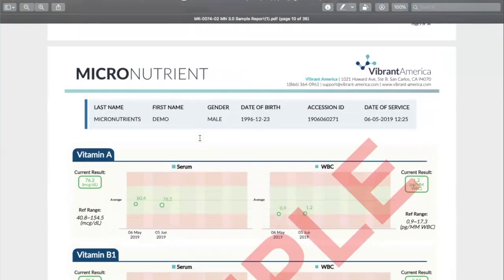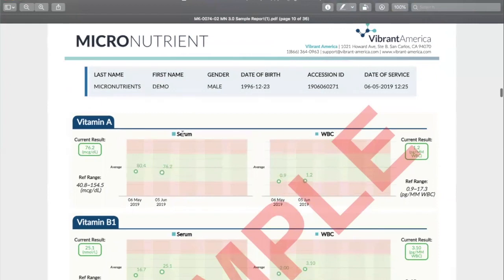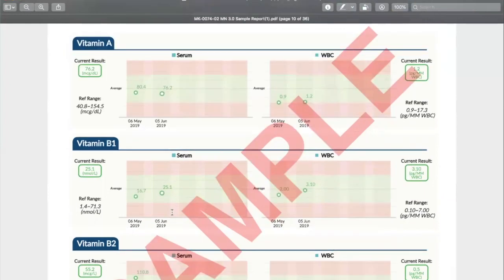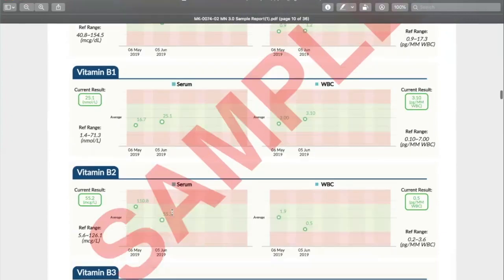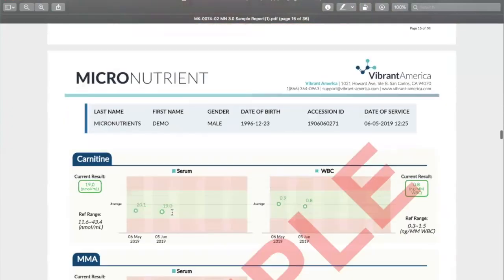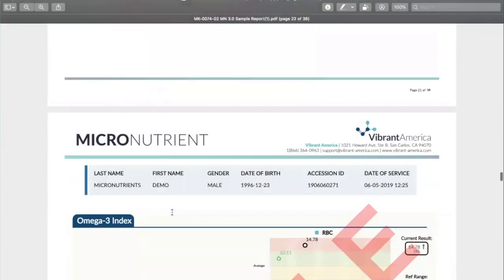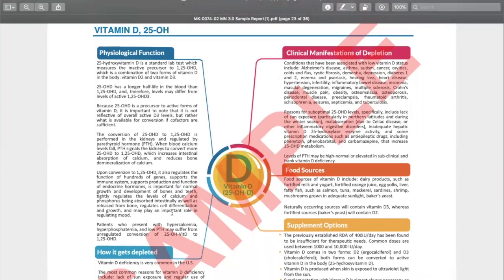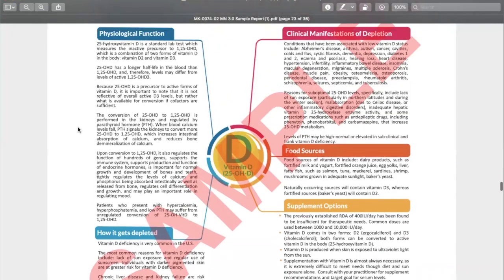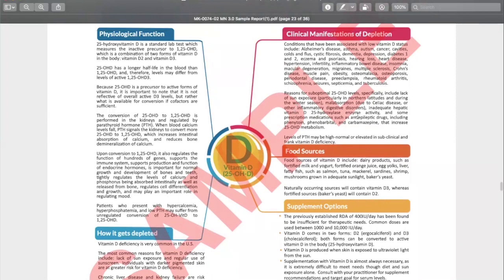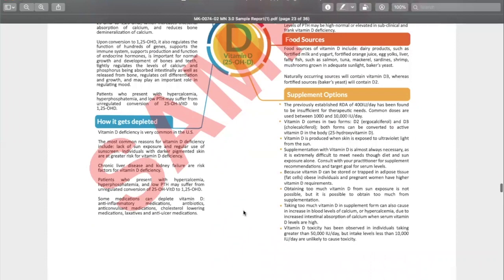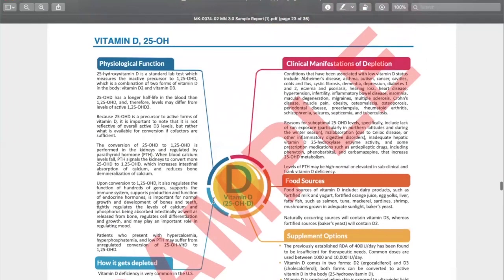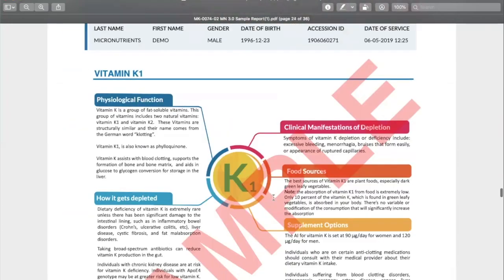If you want to dive even deeper and look at values in relation to the reference ranges, that's the next section — it's the same information presented in a slightly different format. Scrolling past all of these, the last feature of the report — which many people miss — is that for all nutrients with abnormal values, we give you a detailed breakdown of the nutrient: where it comes from, how it can become depleted, clinical manifestations of depletion, food sources, and supplementation options.